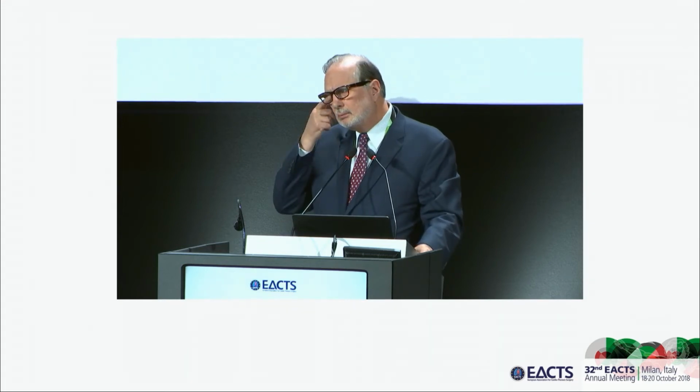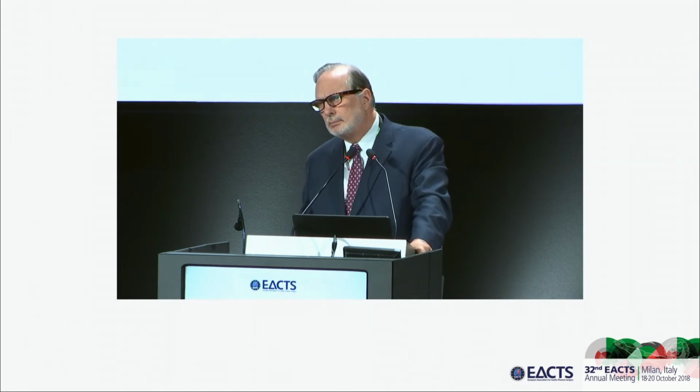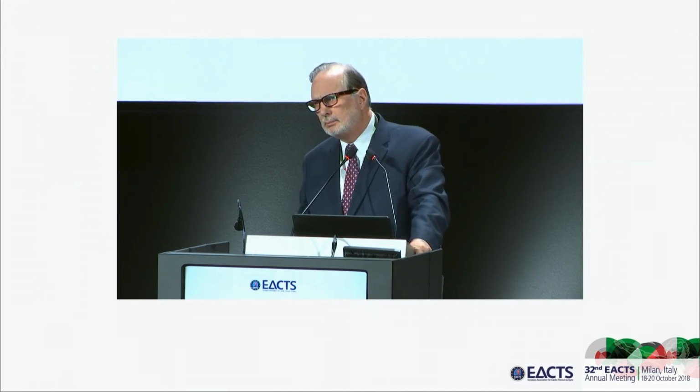Please, number 4. Hi, Armando Juster from Boston. So how does the patient's prosthesis choice impact your decision about what kind of repair you're going to expect? Like, does it make a difference that if they want a mechanical valve, don't want a reoperation, the only repair that is acceptable is perfect repair? Yeah, I think that would make a difference, like a tissue valve in a younger patient. Yeah. How do you make that decision?